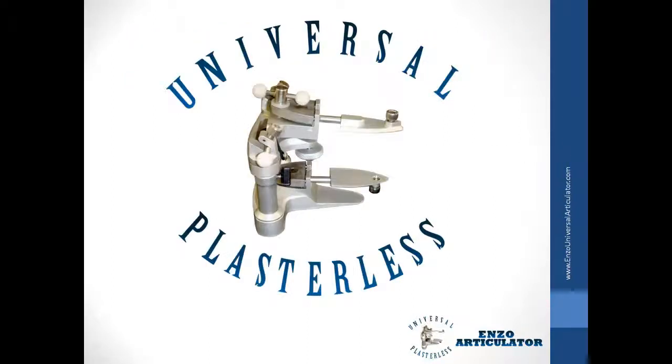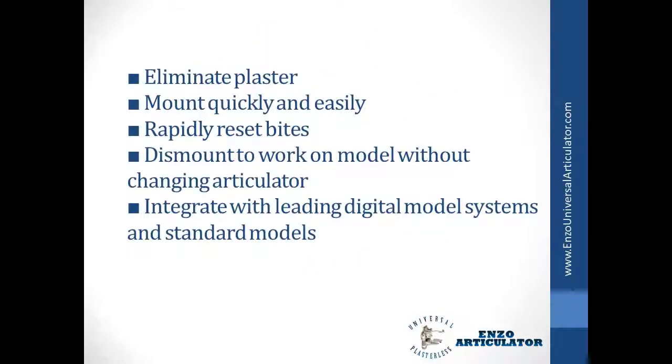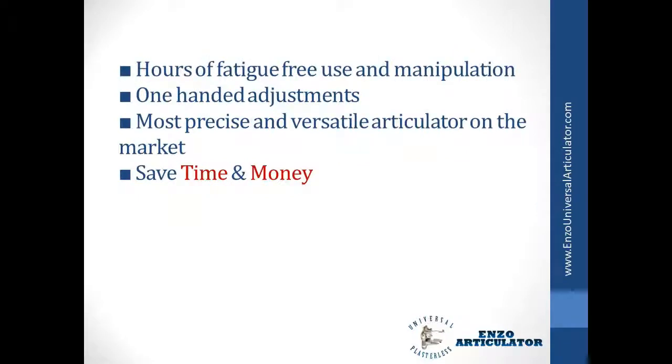The solution is the Enzo Universal Plasterless Articulator. Eliminate plaster. Mount quickly and easily. Rapidly reset bites. Dismount to work on the model without changing the articulator. Integrate with leading digital model systems and standard models. Hours of fatigue-free use and manipulation. One-handed adjustments. The most precise and versatile articulator on the market.